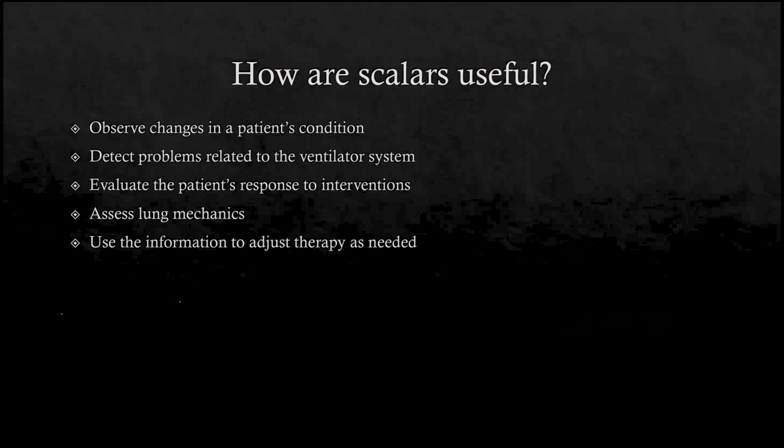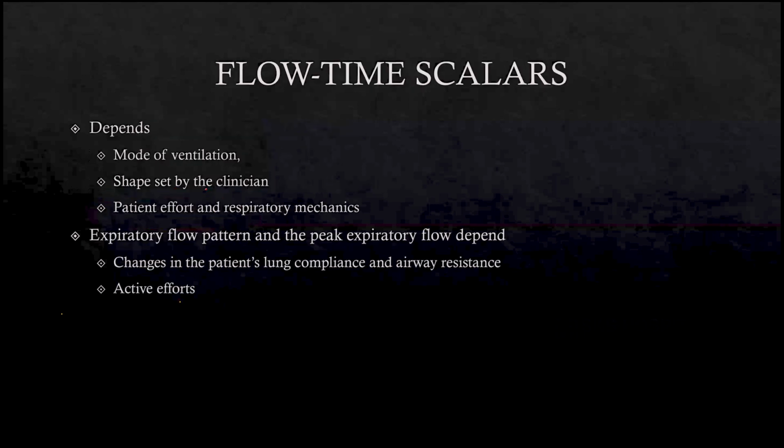It also gives us an idea of the patient's response to interventions, as I said, and a good overall representation of the lung mechanics, which is what we are ultimately very interested to know. And when I say lung, it may not be only lung, but it could also mean the airway. That's why I told you, when we talk about the respiratory system in a ventilated patient, it is the entire system, which is the ventilator, the tubings, any resistance on the way, like your HME filter, the patient's airways, patient's lung compliance, including the chest wall compliance. All these become a part of a system, and also help us to adjust therapy.